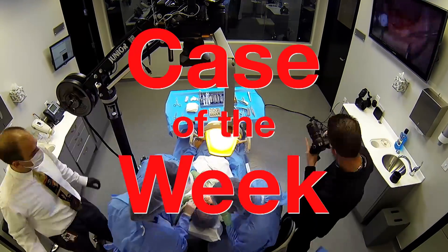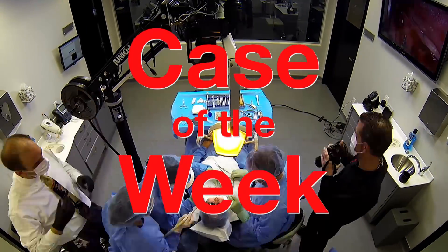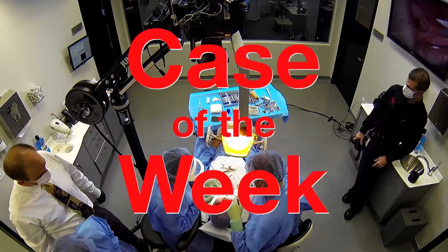Hello and welcome to Chairside Live. I'm your host Megan Strong. In today's show, Dr. Chi is placing his first implant. He's placing a Hahn implant in an edentulous site number 30, following the straightforward protocol of the Hahn surgical kit and then the final delivery of a BruxZir anterior screw-retained crown. Dr. Chi, it's all yours.